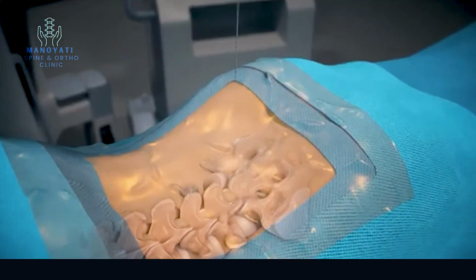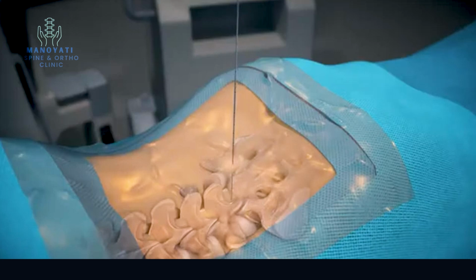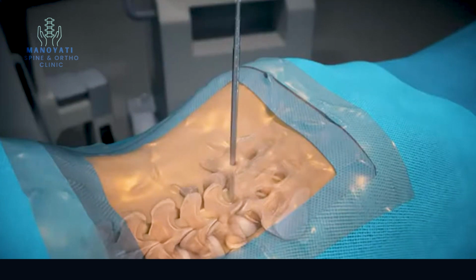Insert a spinal needle, remove the stylet, and pass a guide wire through the cannula, and then remove the cannula. Insert serial dilators over the guide wire until the appropriate diameter is achieved. Continue utilizing dilators for steps 2 and 3.